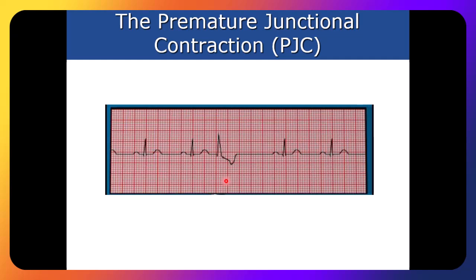The T wave is larger. So we could potentially have a T wave and a P wave together. All right, so that's going to be the two reasons. Faith said the T wave is inverted. That's a little weird, but if we have an inverted P wave, that may be the reason. And as H said, the T wave is larger than the normal T wave it looks in there.